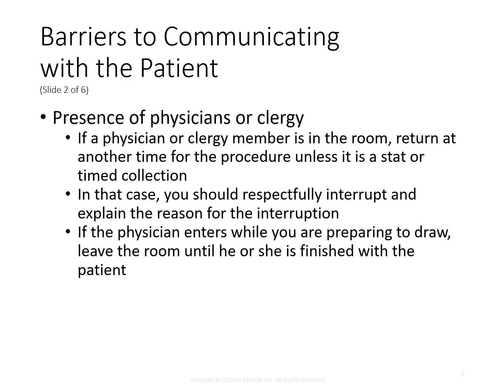In that case, you should respectfully interrupt and explain the reason for the interruption. If it is a stat or timed, let them know why you're there. Lots of times with the physicians there, they're talking to the patient or there's some explanation that needs to be done. So we just need to let them know, hey, we're here for a stat lab, and they will more than likely allow it to occur. If the physician enters while you are preparing to draw, leave the room until he or she is finished with the patient. Again, this is going to go back to the protocols of your facility, so just make sure you're up to date on what you need to do there.